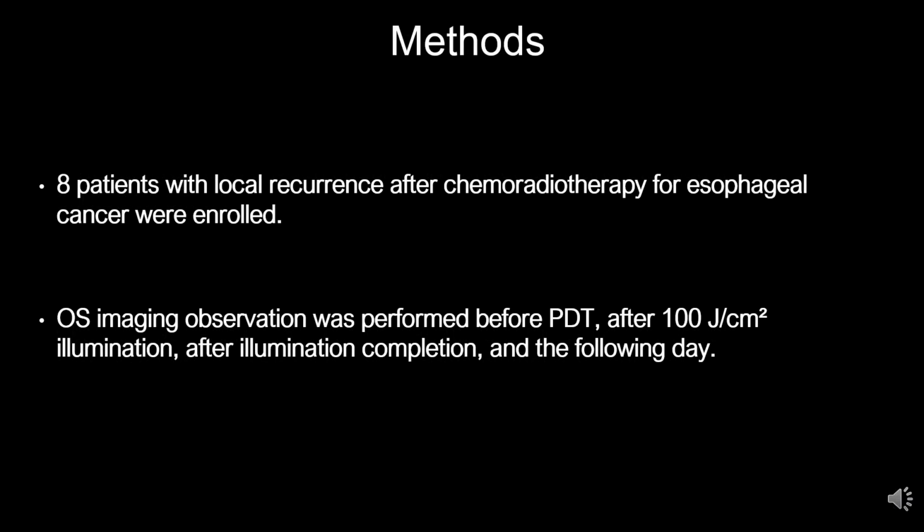Eight patients with local recurrence after chemoradiotherapy for esophageal cancer were enrolled. OS imaging was performed before PDT, after 100 joules per square centimeter illumination, after illumination completion, and the following day.